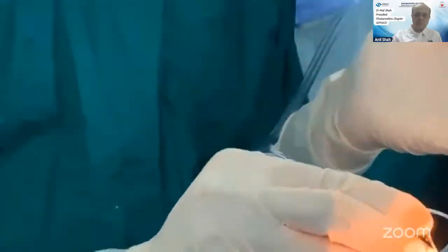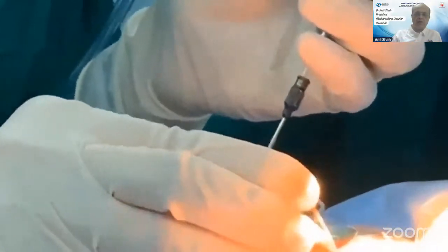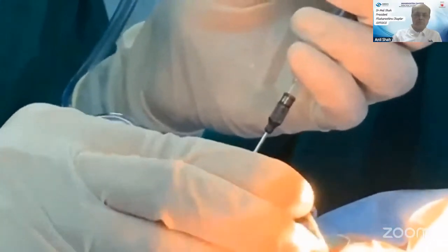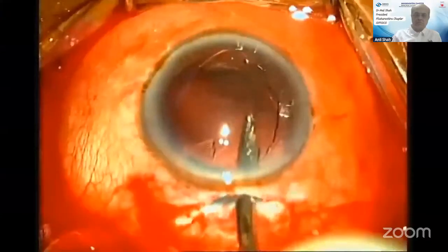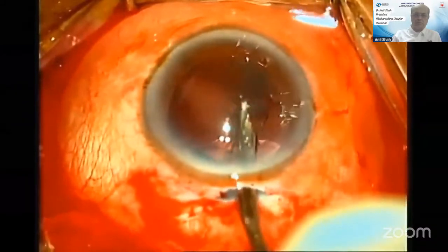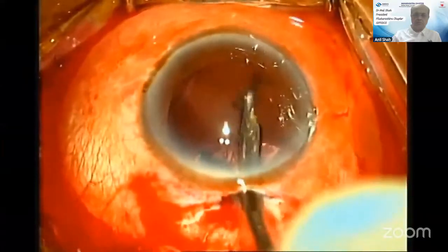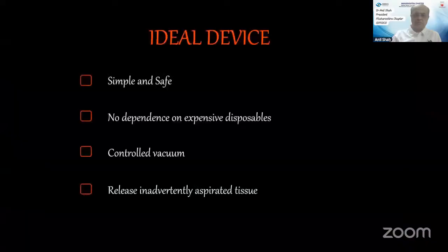The gradual and gentle vacuum gives us the liberty to hold the syringe freely in left hand and concentrate on cortical aspiration, making it more advantageous for beginners and trainees. Also, the larger volume of effective aspiration helps complete cortical cleanup in one go without the need to repeatedly flush out the aspirated contents. VCR fulfills all the criteria for an ideal device.